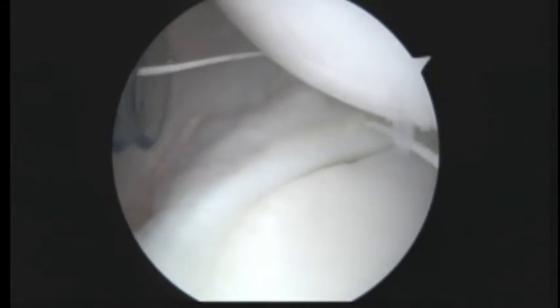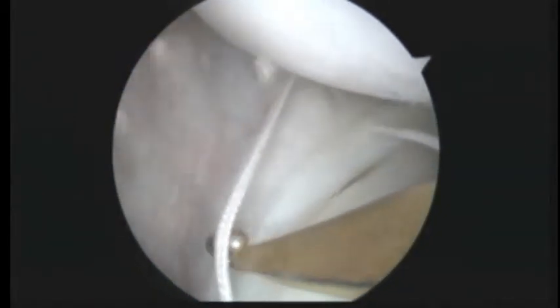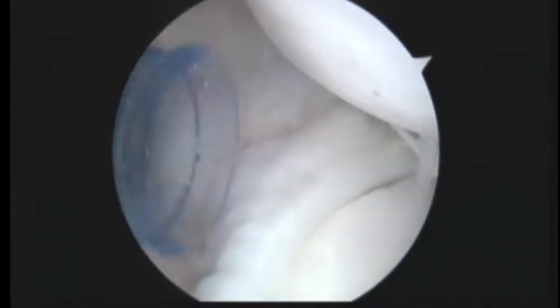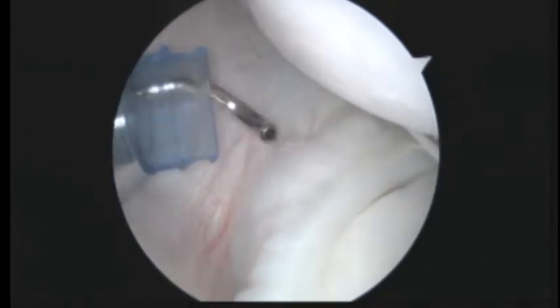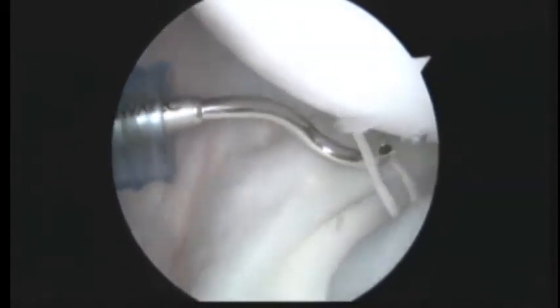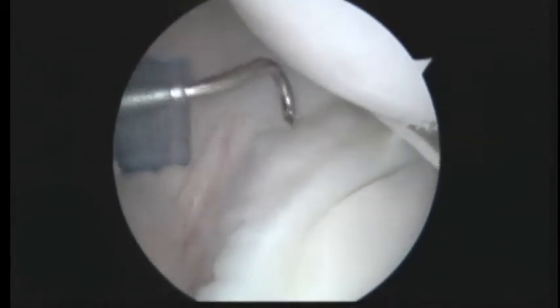We're going to go ahead and reach in and get the suture limb in the back again, just like that. And now we're going to use that same suture hook. Give me a grasp, please. That same suture hook to pass another stitch. Start here.